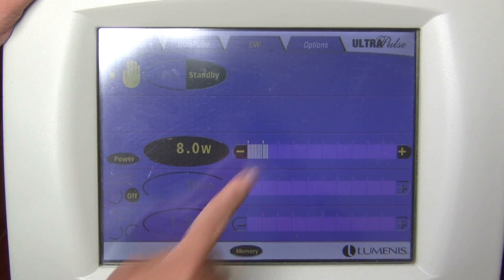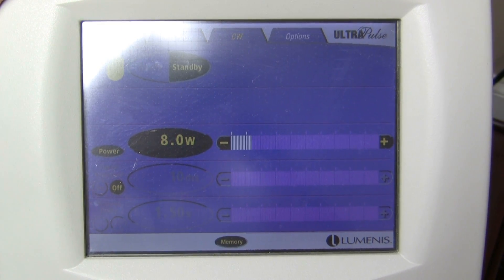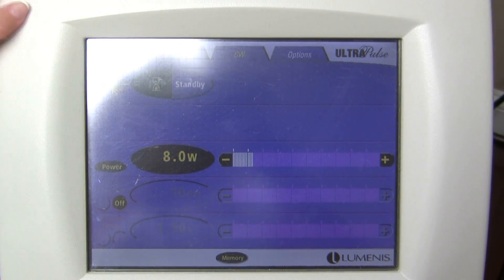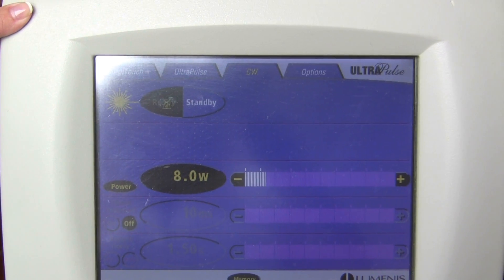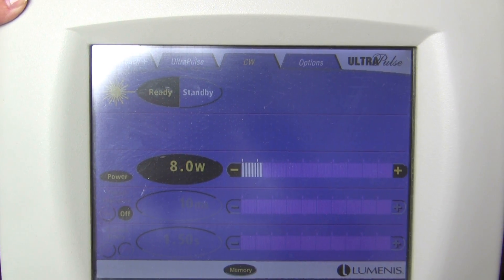If the doctor is in the middle of a surgery and wants the power up or down, just use the plus or minus sign to get it to the desired number. Then when ready, hit the ready button — that will allow the doctor to use the laser with the pedal.